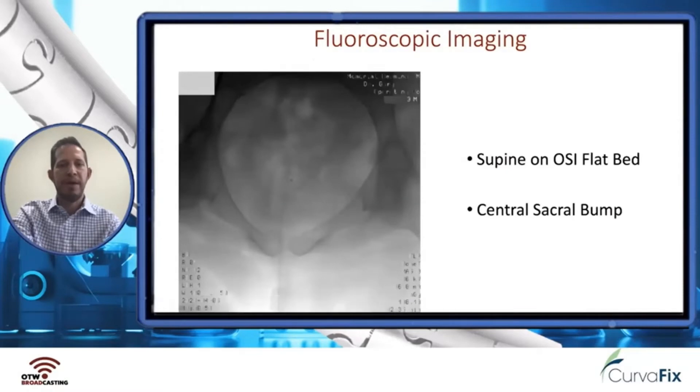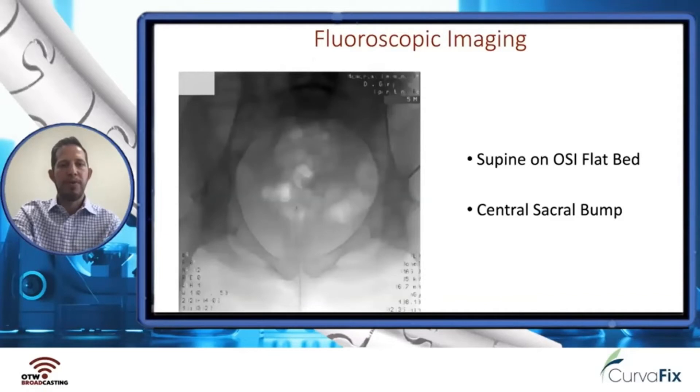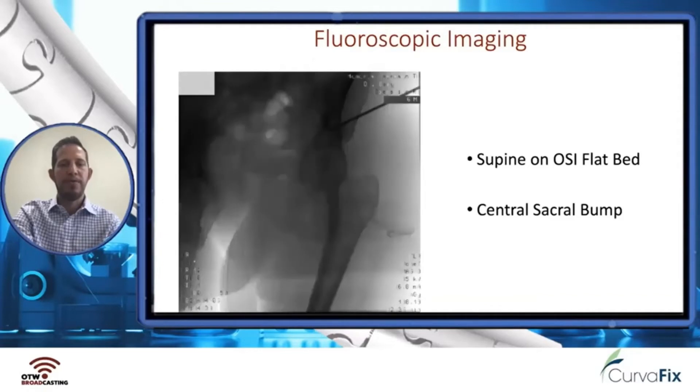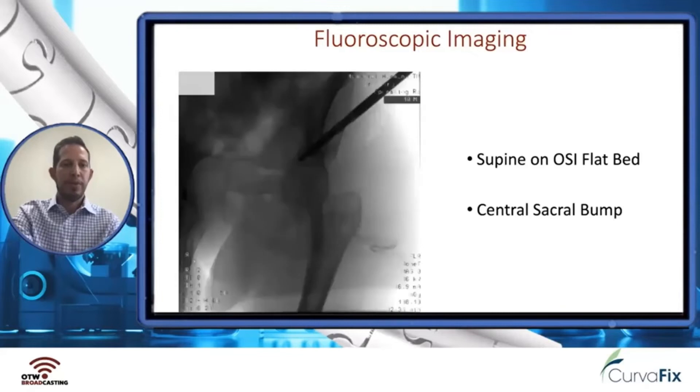She was supine on an OSI flatbed with a central sacral bump. We get our starting point with the standard views for the anterior pelvis and superior ramus — obturator outlet imaging and inlet imaging. You can see our guide wire starting, and then our entry reamer going in.